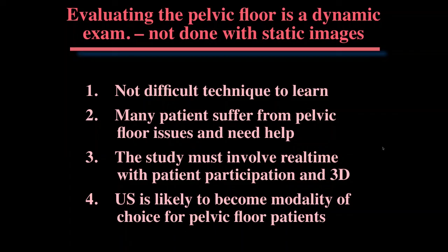We have seen the patient empty the bladder for a transvaginal exam, as here images have fluid-filled bladders. Is it better to have a fluid-filled bladder for pelvic floor? Well, believe it or not, all these patients have emptied their bladders. There's a little bit in the bladder. A lot of times when a patient empties her bladder and you're about to do the vaginal probe, you know that there's still a little bit in the bladder. And it's not a bad thing to have a little bit in the bladder just to outline it. But all these patients have theoretically voided.